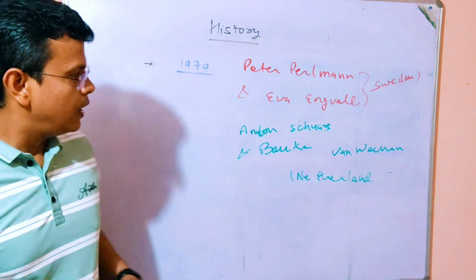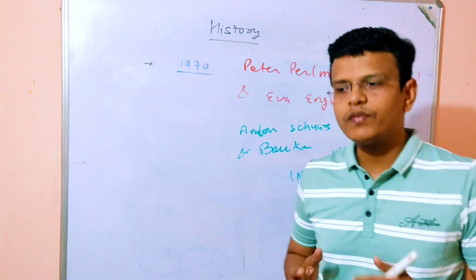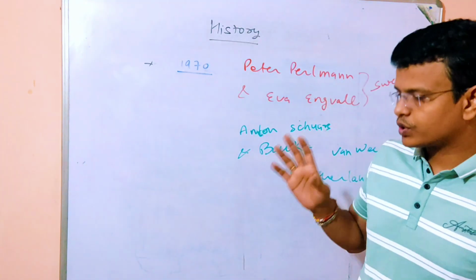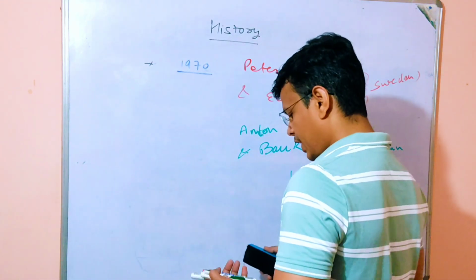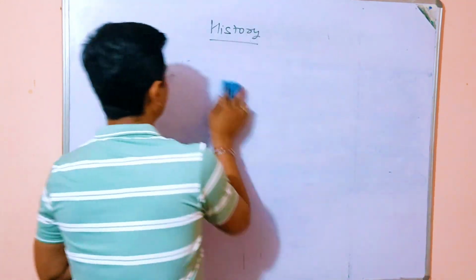Okay. It was designed as a safer and more efficient alternative to the RIA. As I mentioned, it was safer and more advanced, and it has now become a key tool for various tests and quantitative analysis.